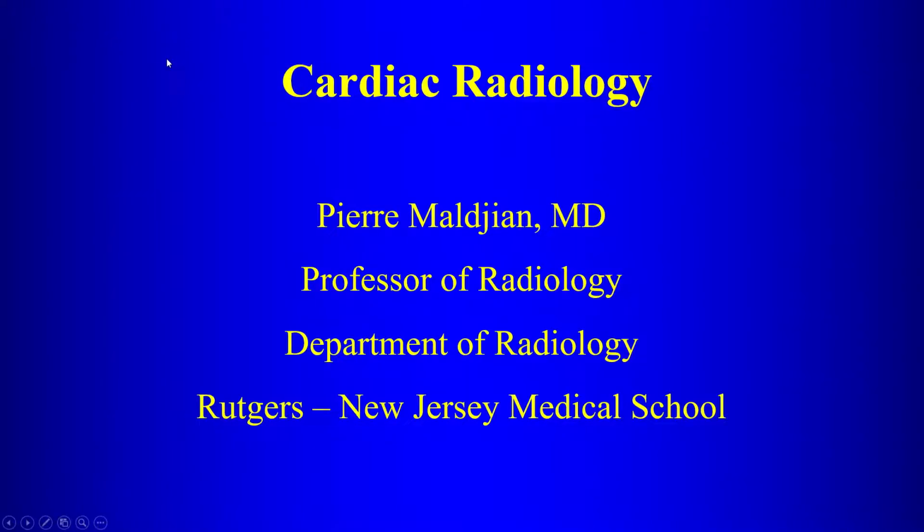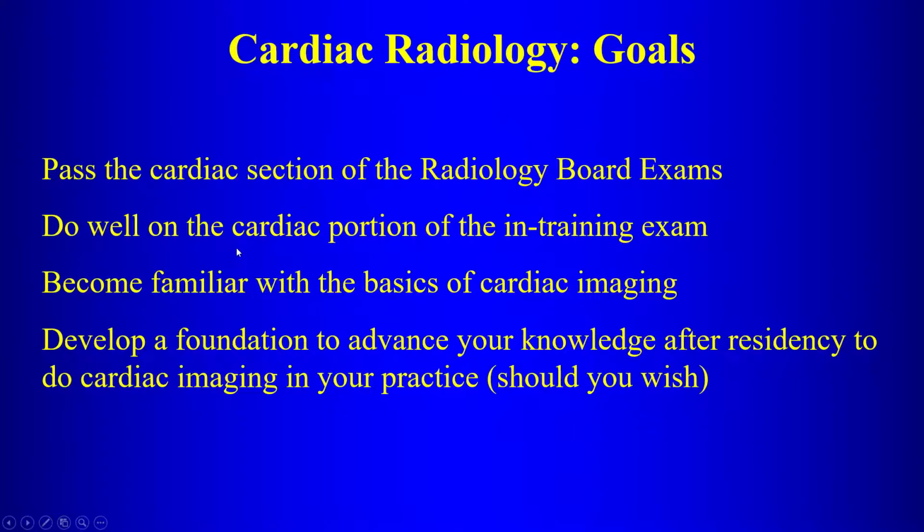Okay, so we're going to begin a series of lectures on cardiac radiology, and this series is directed at radiology residents. The goals for this series of lectures are to help you pass the cardiac section of the radiology board exam, do well on the cardiac portion of the in-training exam, become familiar with the basics of cardiac imaging, and develop a foundation to advance your knowledge after residency should you choose to do cardiac imaging in your practice.